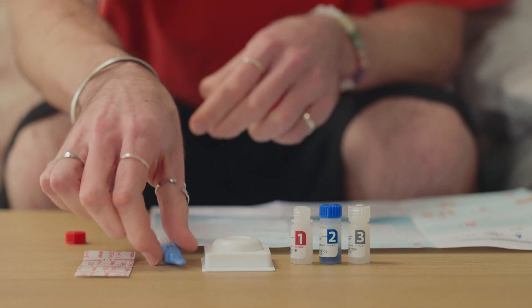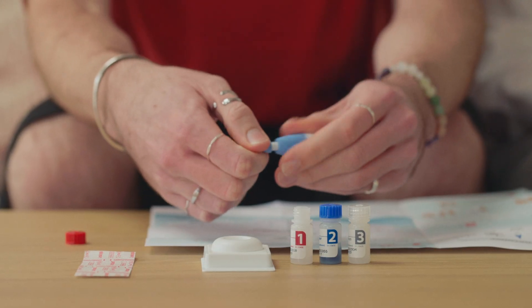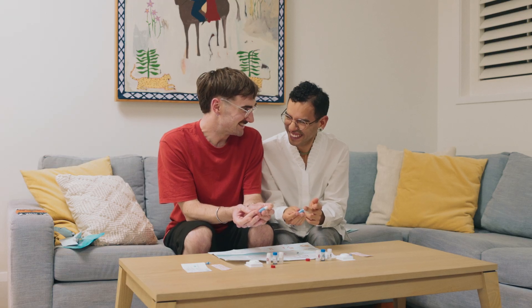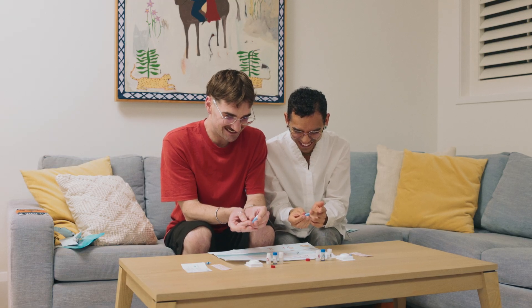Step 3. Take the finger prick device and place it against the side of your middle finger. Press firmly. You will feel a quick prick as the needle extends and retracts automatically.